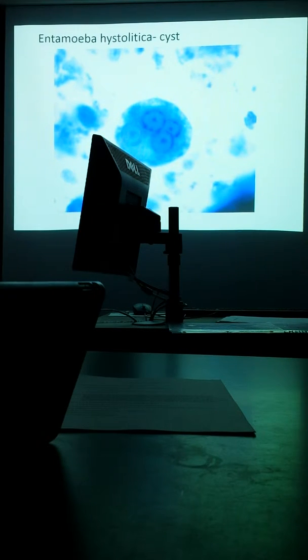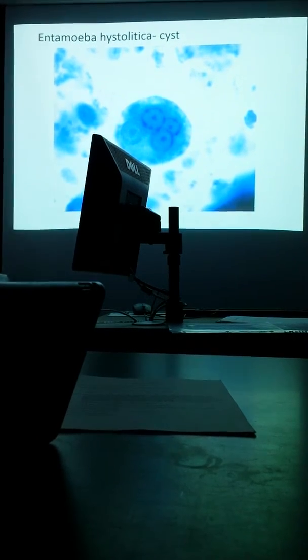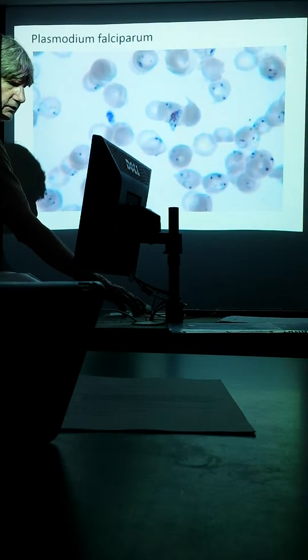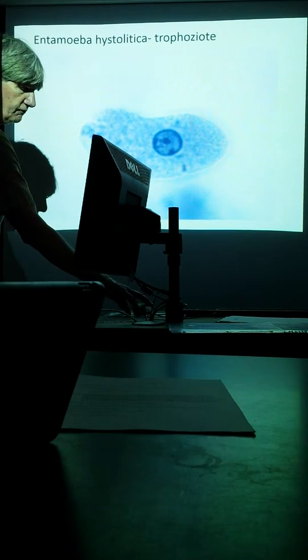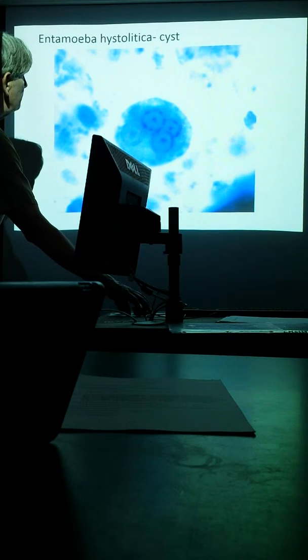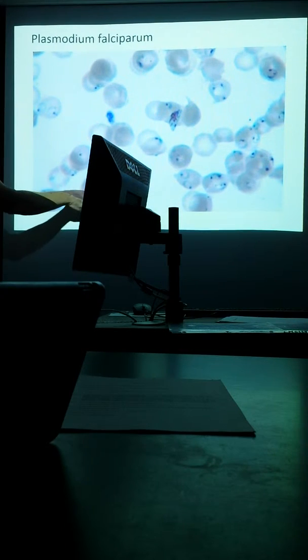The cyst has the 4 nuclei. This pattern where you've got the spot of DNA and the ring around it is called a karyosome. And so anyway, that is characteristic of this group, and you can see we have the same thing back here on this one as well. So very distinctive for the amoeba group.